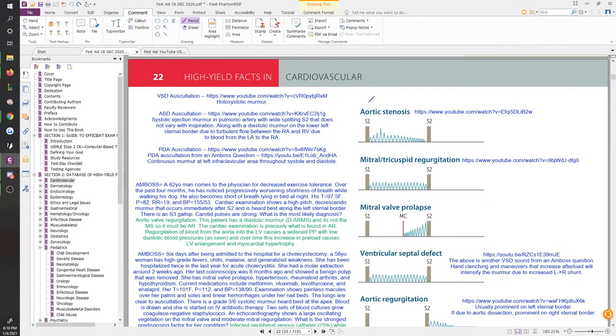We gained a bunch of new things, which was your ECG reading tools, right? You have your William Marrow, your Rad-Ralph and Lad Villa, right? You have your P pulmonale, P mitrale, looking for the M in Marrow and the M in William for V1 and V6 and stuff like that. All of those different things. Your R-wave progression that we talked about.